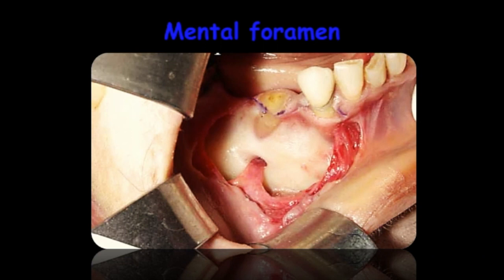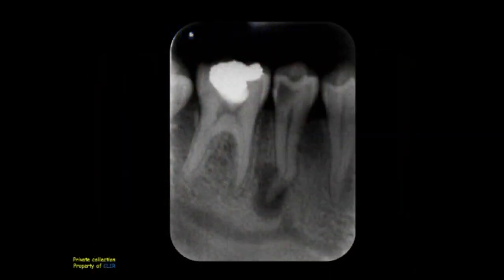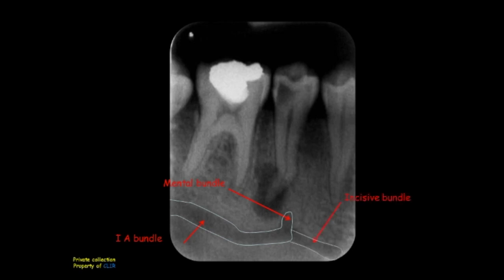As you know, the mental foramen is the anterior exit of the inferior alveolar canal. As we can see on this periapical image, the inferior alveolar neurovascular bundle will split into two parts. A large trunk will exit the mandible through the mental foramen — called the mental nerve — and a small trunk, the incisive nerve, will continue anteriorly through the incisive canal.